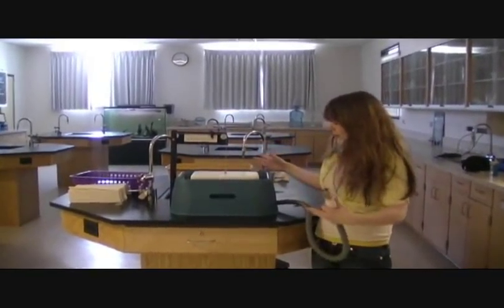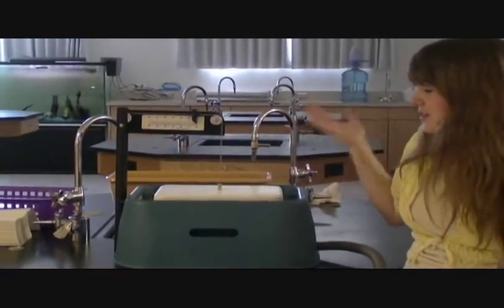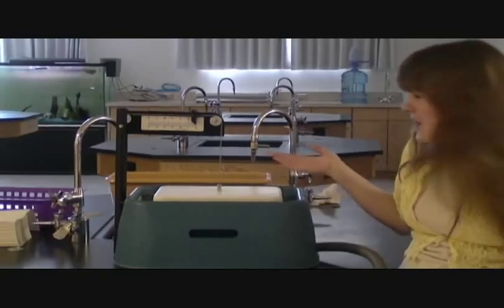So inside this tub there is a ton of water, and this kind of weight measure thingy — I don't know what it's called, but that's okay.